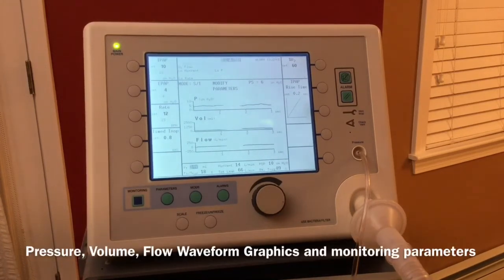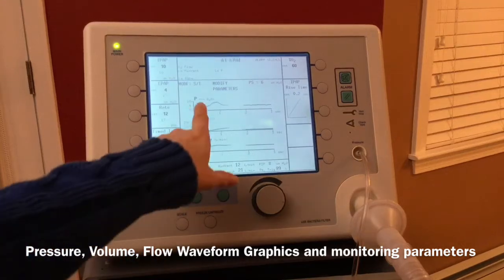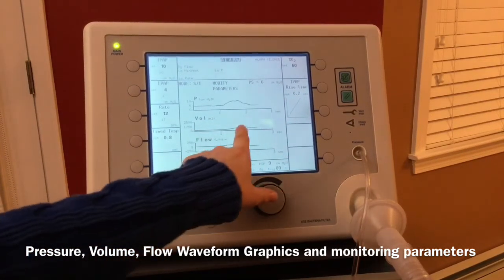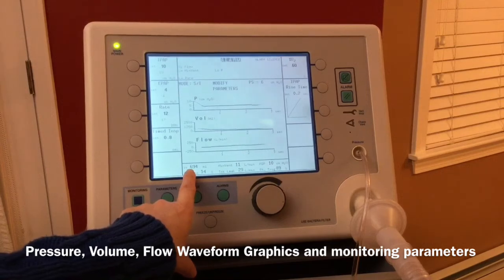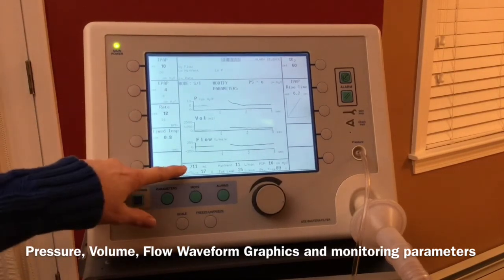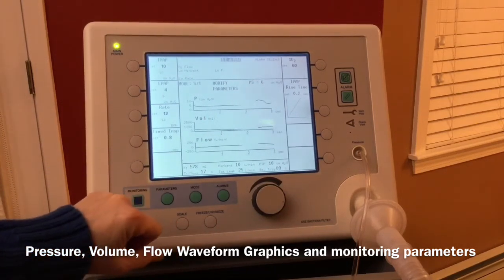Let's look at the waveforms on the bilevel ventilator on the current standard settings. We have a pressure curve when the patient breathes in. We have a volume curve that shows us how much volume per pressure, and then we see the flow of the patient. Down here you can see the average tidal volume for this delta pressure change of 6, which is giving us about 600 to 700 mLs per breath.